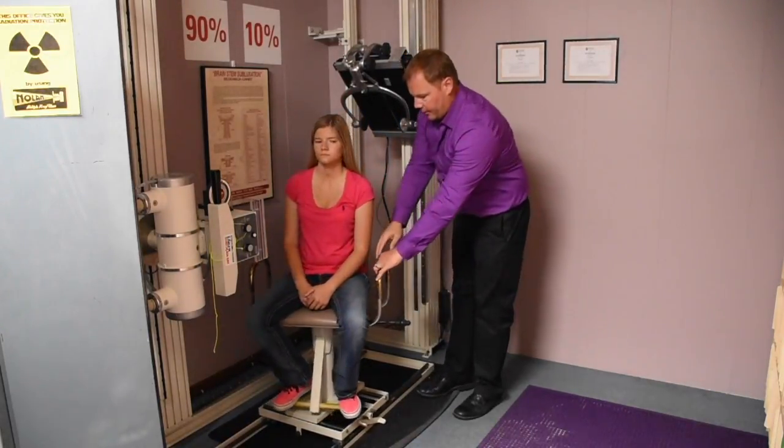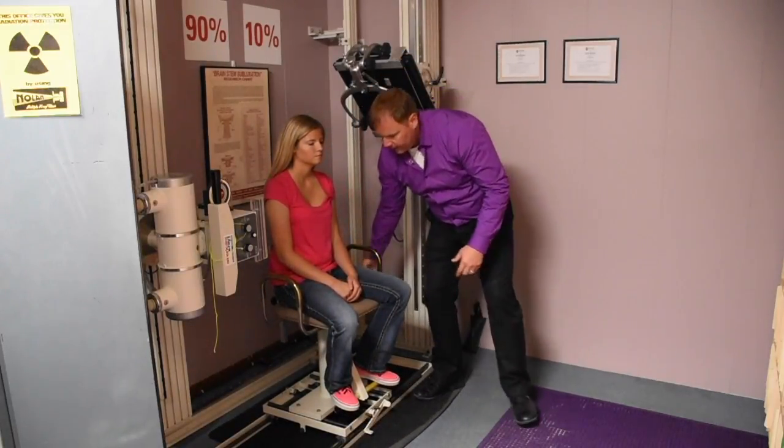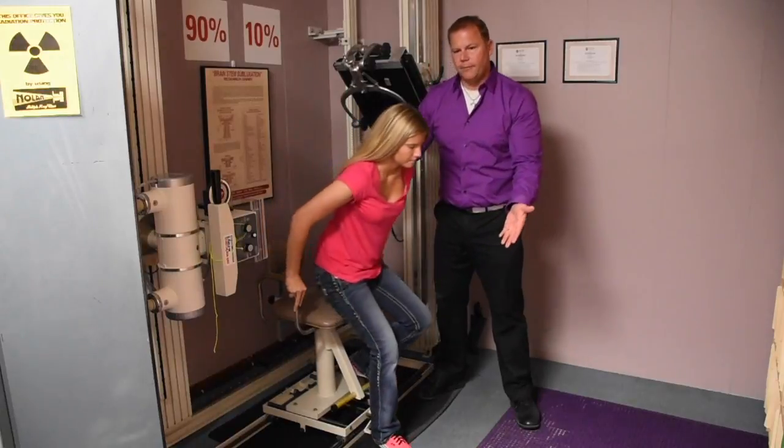Then we leave that, turn the patient, lock the chair just like that, and go ahead and step right out of the chair.